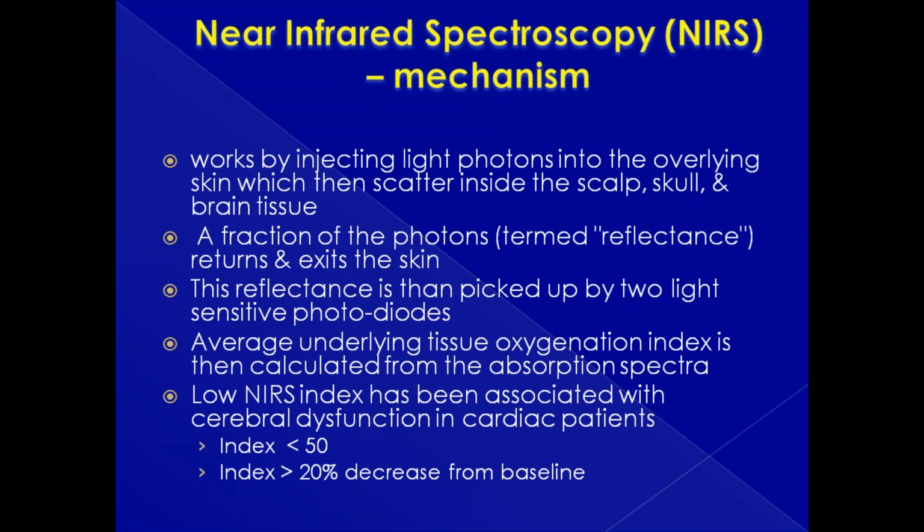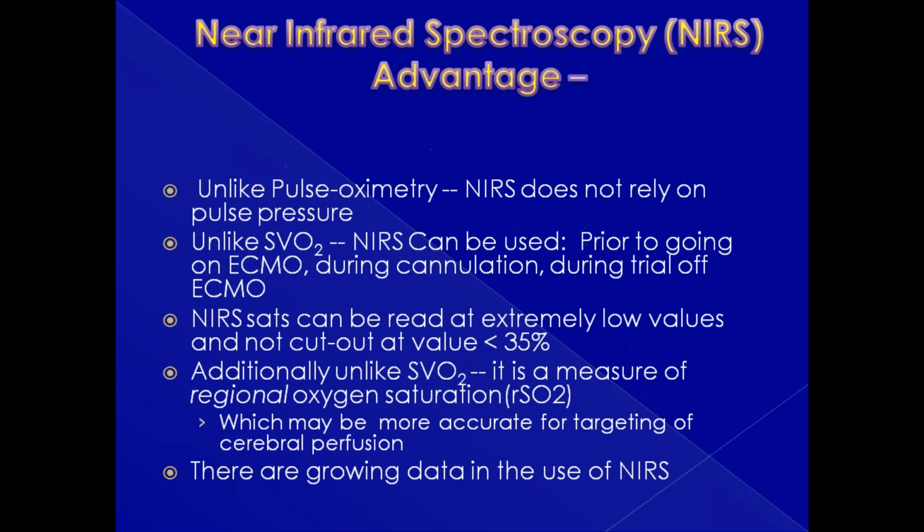It works by injecting light photons into the overlying skin, which then scatter inside the scalp. By the principle of reflectance, the light returns and exits the skin, and we can read that with the photodiodes.